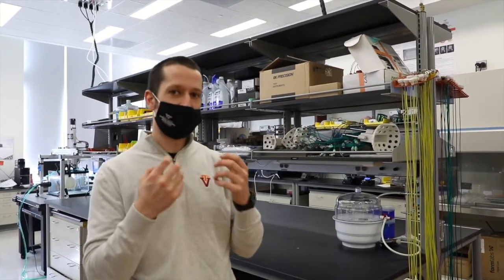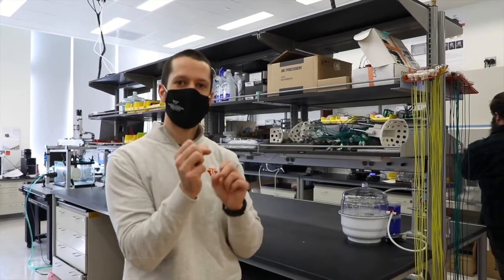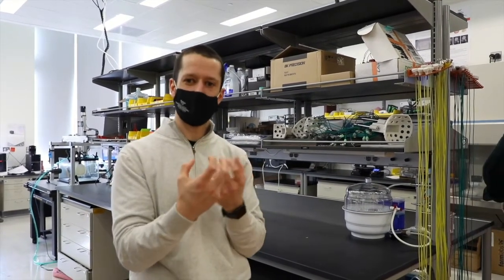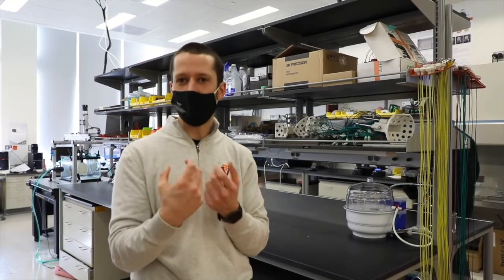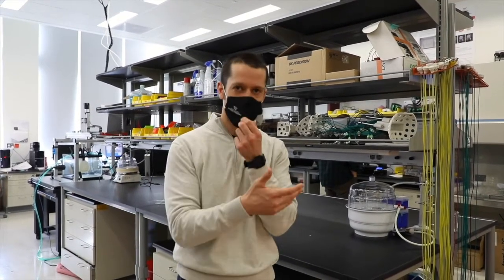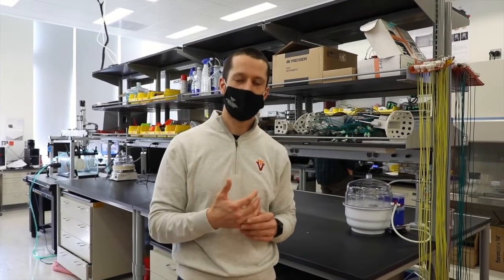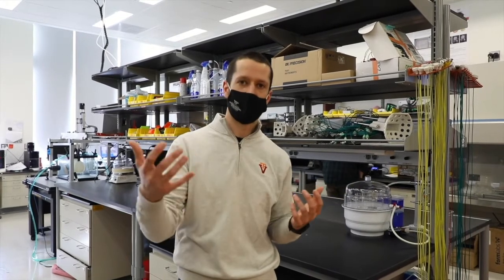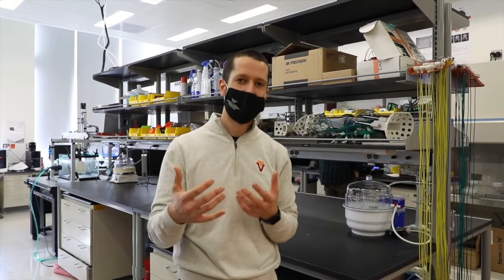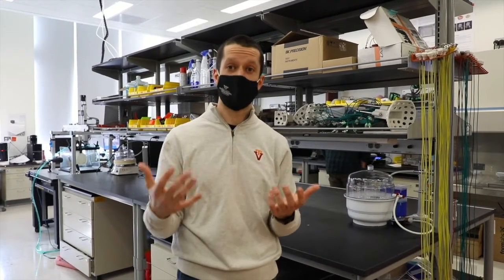But basically, we generate these cavitation bubble clouds that are really localized at a focal point in the tissue. These bubbles expand and collapse and basically destroy the tissue into a liquid debris. So one of the big applications for this is non-invasive cancer surgery. So in 2019, with our partners at Histosonics, which is a company developing this technology for the clinic, as well as our clinical teams in Wisconsin, Michigan, and Barcelona, where the trial is run, we did our first human trial using histotripsy for the treatment of liver cancer.